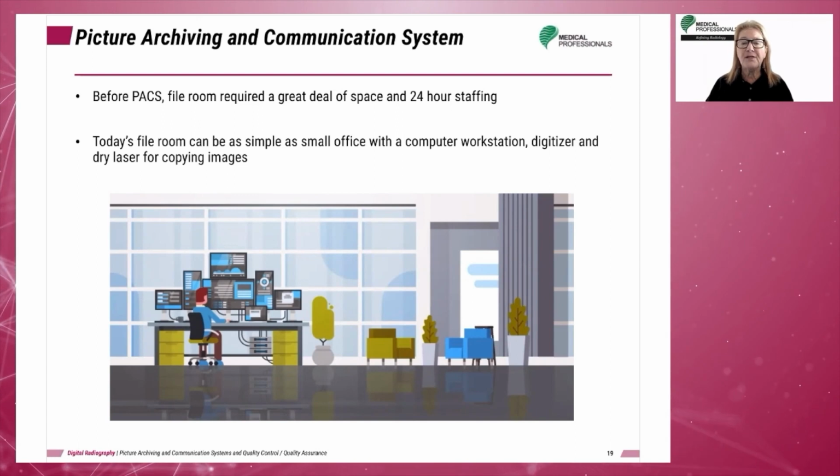PACS has replaced the traditional radiology file room, which was a costly operation and not an efficient method of managing medical images and reports. The traditional file room occupied a great deal of space within the institution and was labor-intensive.